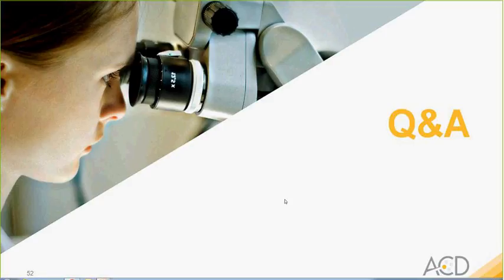If those faint dots are present in the DapB slide, then they're likely representative of background staining. However, if they're absent, those faint dots seen in the target probe slide may well represent low level expression of the target probe in that tissue. The recommendation would be to attempt to optimize the protocol to make those dots brighter to see if in fact they really do represent true expression.